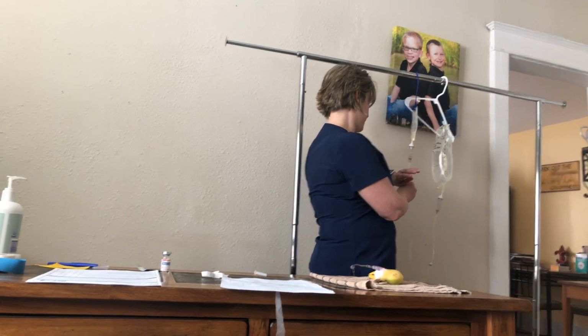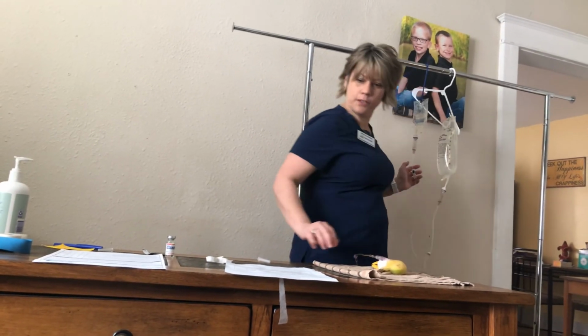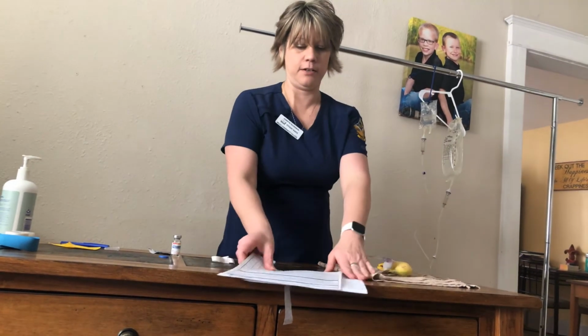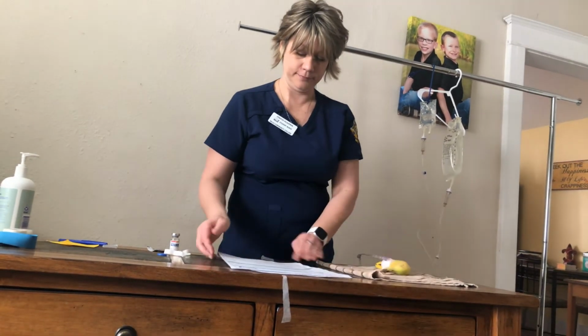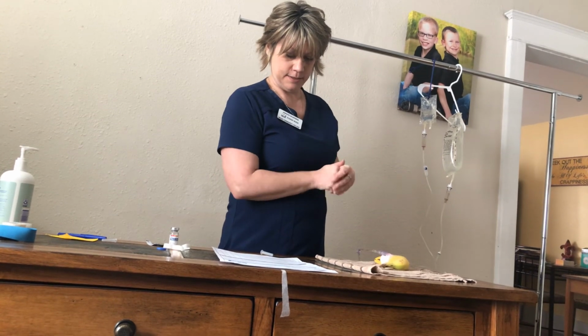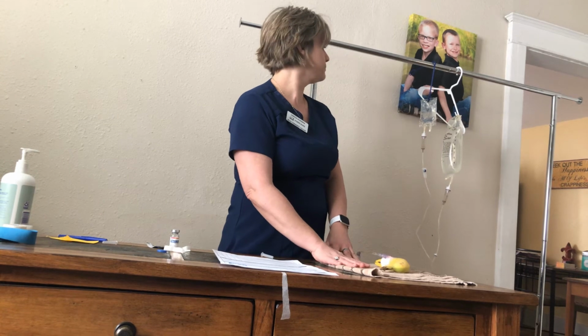Okay, that is going. I'm going to go back and double check. Ivy, how are we doing? Ivy's doing great. I'm going to perform some hand hygiene, and I'm going to continue to check on Ivy throughout this.